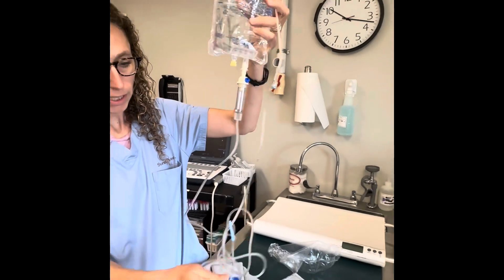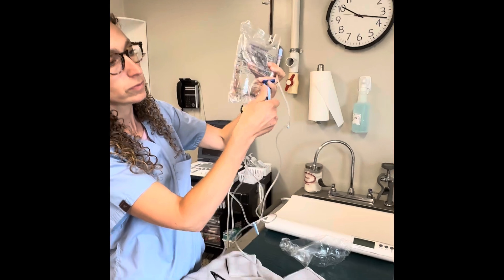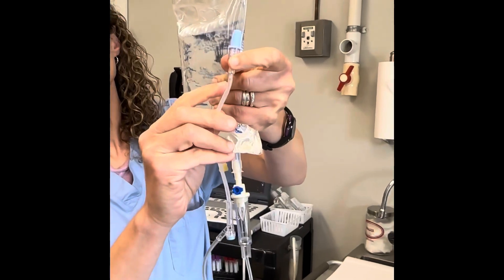I'm going to kink it by rolling this wheel all the way down. I want to make sure the fluid has come all the way down the line, which it has.